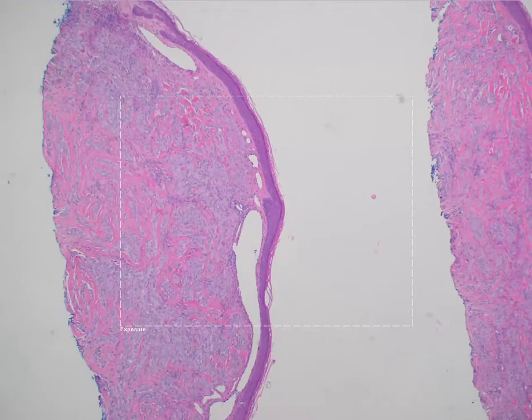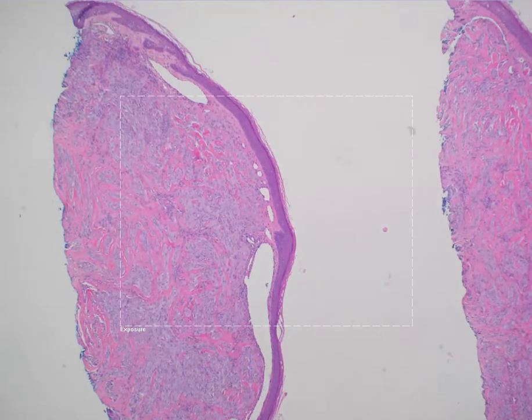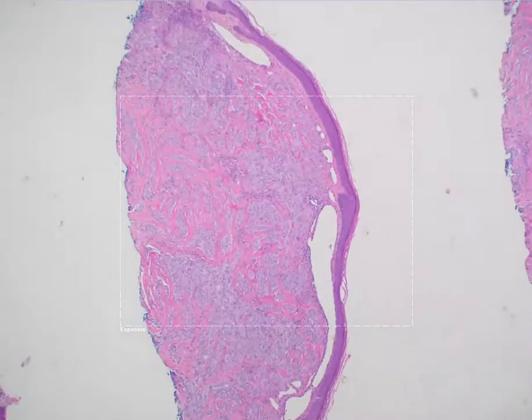You can see anywhere from a hypocellular myxoid stroma all the way through to hypercellular presentation with a very densely pink collagenous stroma. This lesion really, I think, borders more on that hypercellular kind of collagenous stroma appearance.